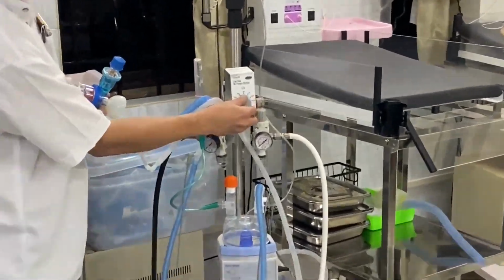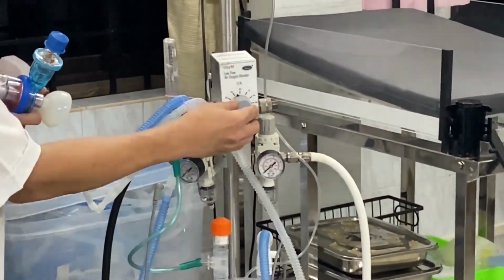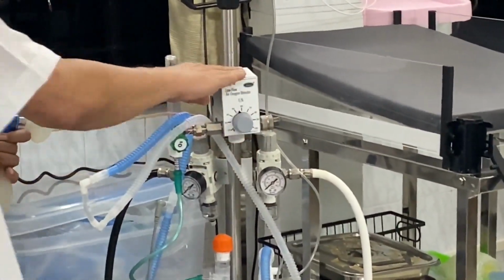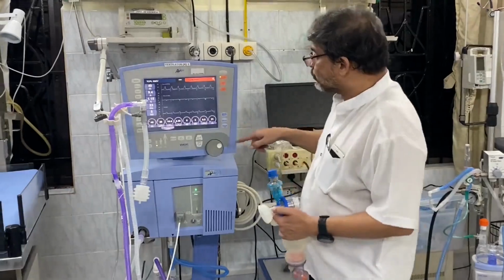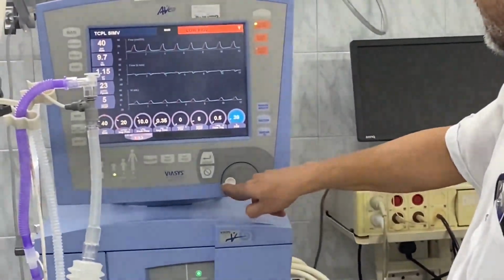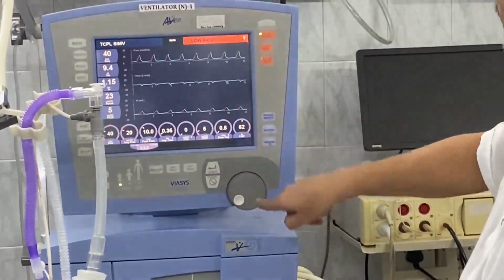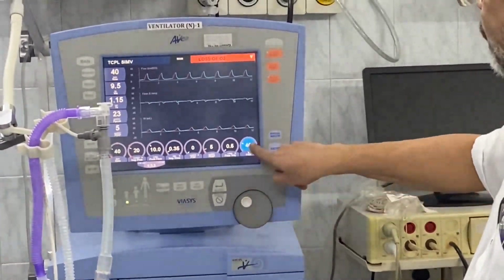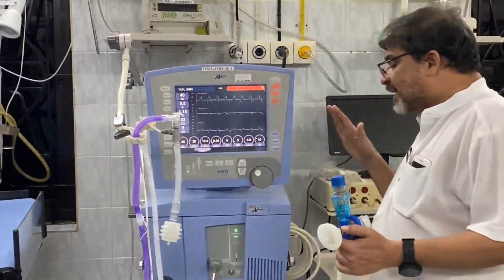You can adjust your FiO2 on this. If you want 40%, 50%, or 100%, you can adjust it. This is known as a blender. So the ventilator has a blender inside, it mixes oxygen, and you set the oxygen percentage required by dialing onto this. Now I am giving almost 62% oxygen to the patient. Suppose the patient is improving, I can decrease it to 40%. So these are the basic settings of the ventilator.